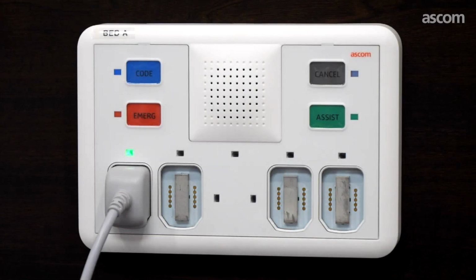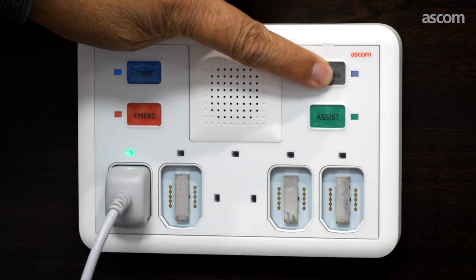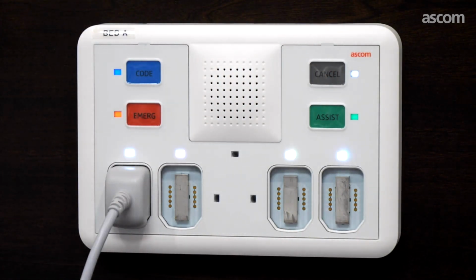Second, how to do the cleaning. Slightly moisten the cloth with an approved cleaning solution. Ensure no lights are illuminated or flashing. Press and hold the patient station's cancel button for 4 seconds until its LED flashes once, then release the button. Cleaning mode disables the station for a period of time so any button press doesn't cause an alarm.